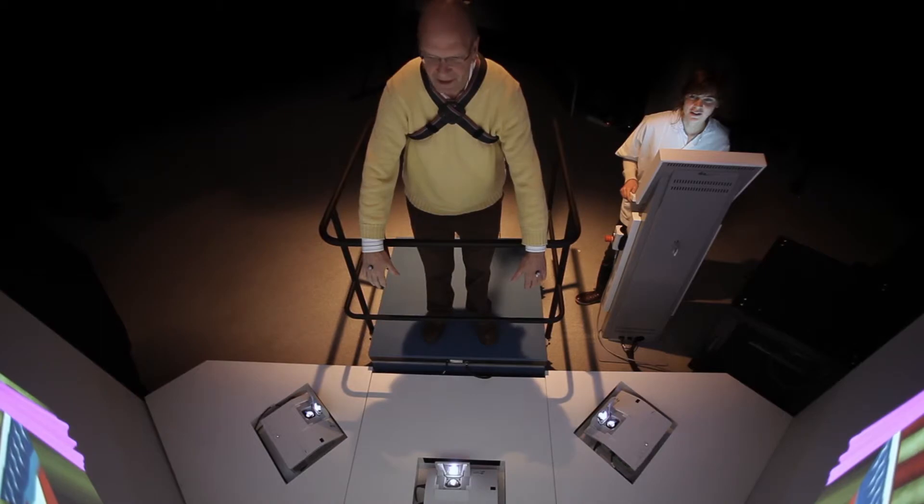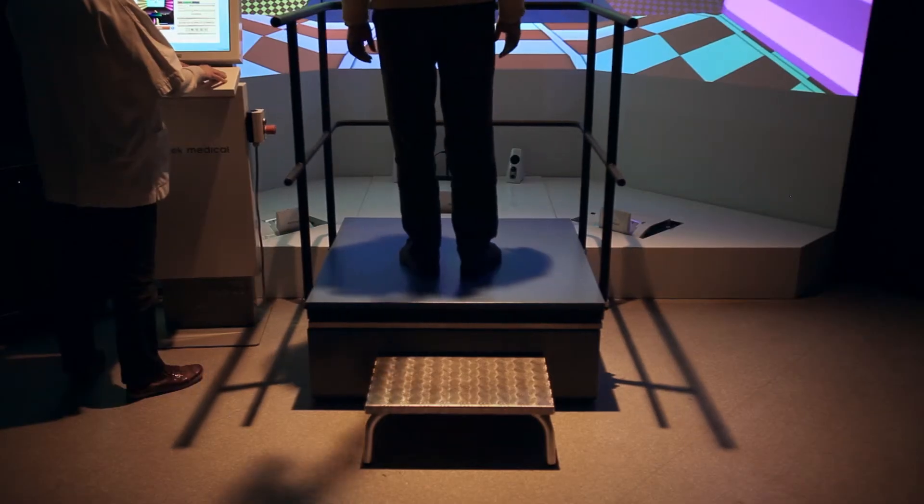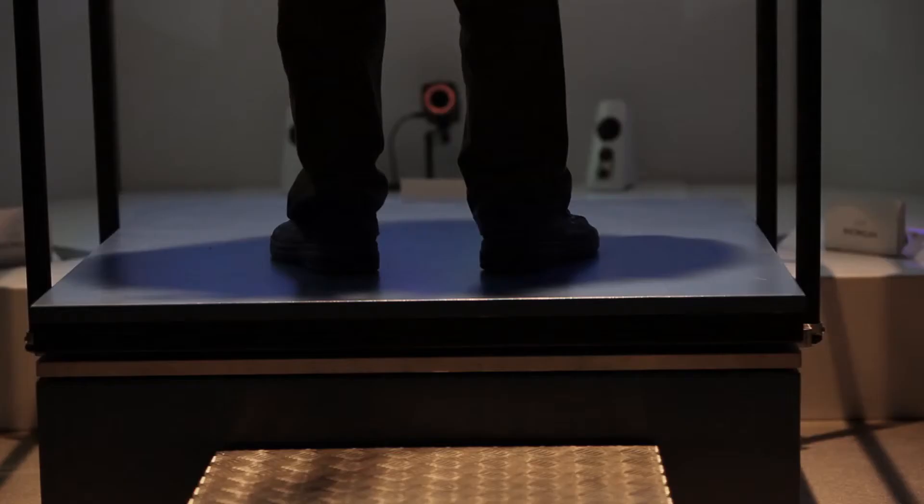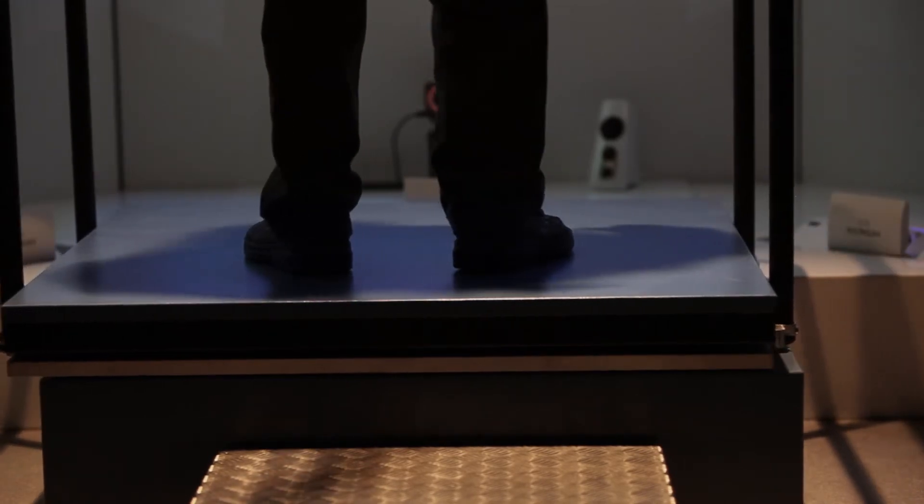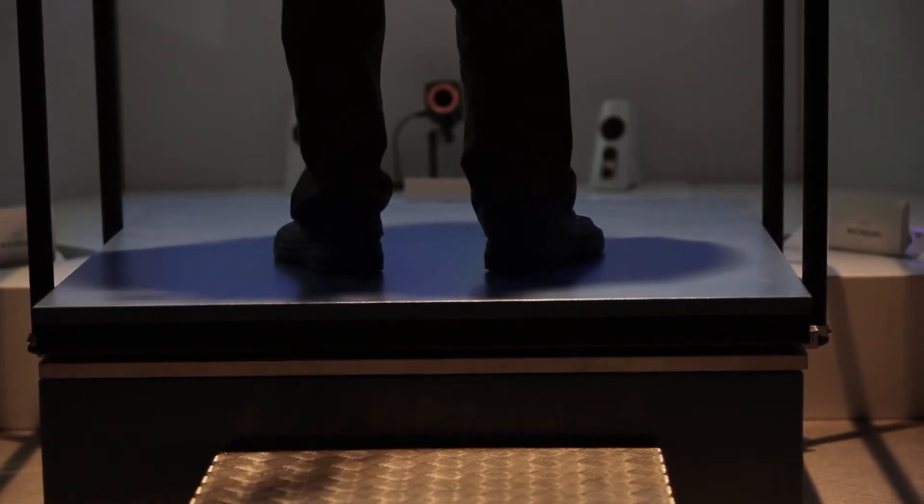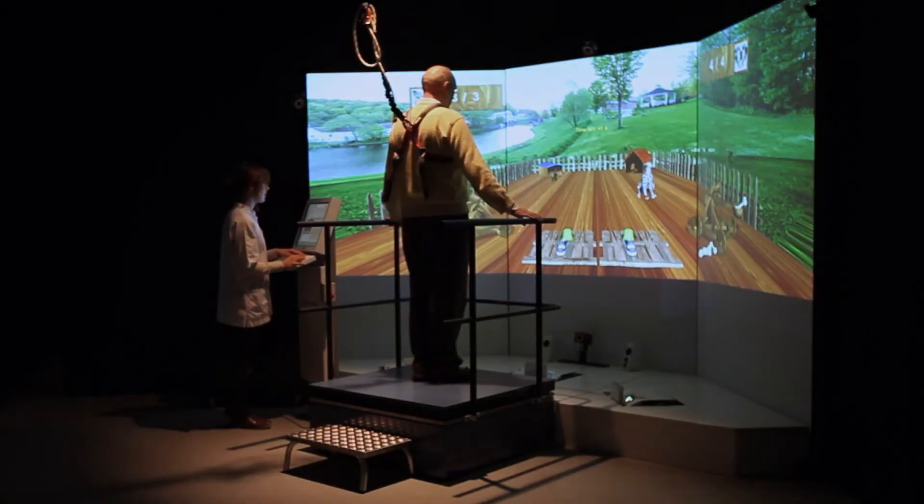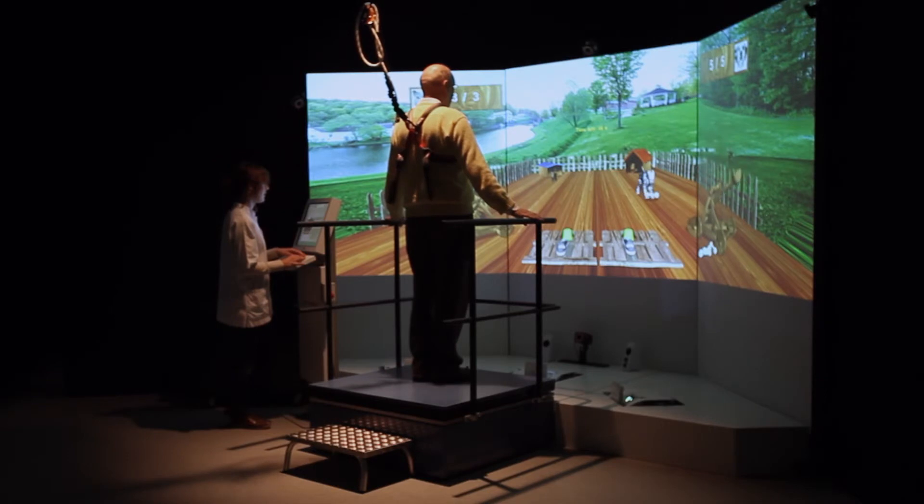Applications which target specific therapy goals can be used, like queuing or weight shifting. The balance control system is maximally challenged by the moving platform, while multi-sensory input improves functional recovery.